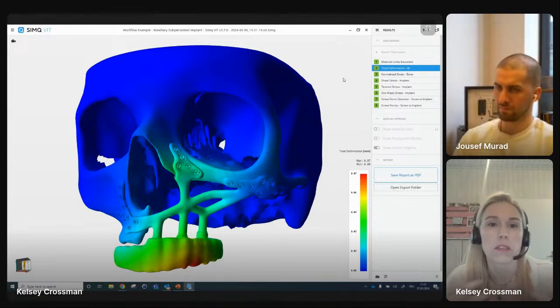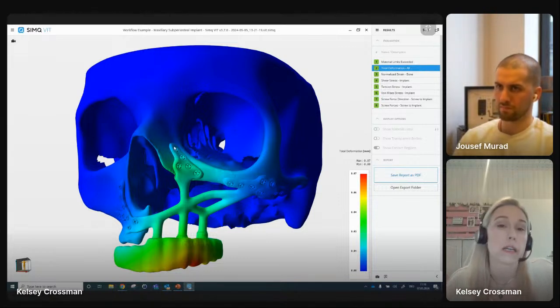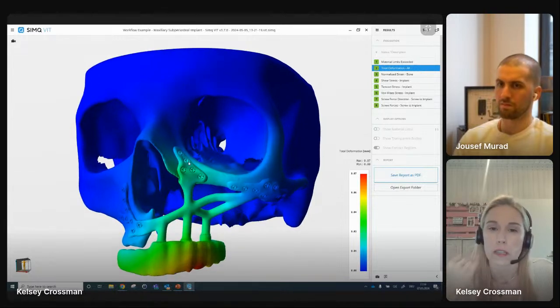The engineer would know what the normal force would be, and then you could say, let's try to lower the Newton force a little bit and change that design, maybe add a bar here. Or if it's acceptable between the engineering and the surgeon, and the bone quality is good, the surgeon will know there's strong bone here. This was removed, but we have a good zygomatic arch here that can support that, and I feel confident that that's the right implant design for this patient.